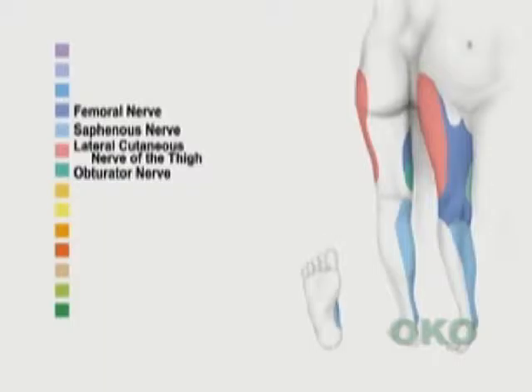The continuous femoral nerve block almost always involves the lateral cutaneous nerve of the thigh, the obturator nerve, and femoral nerve if the catheter is advanced under nerve stimulator control next to the nerve. In young, fit, healthy male and female patients, there is no or very little brown fat surrounding the femoral nerve, which makes catheter placement in these patients more challenging, and patience is usually required.